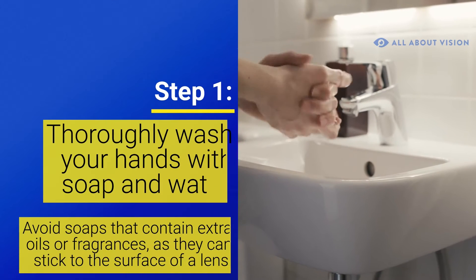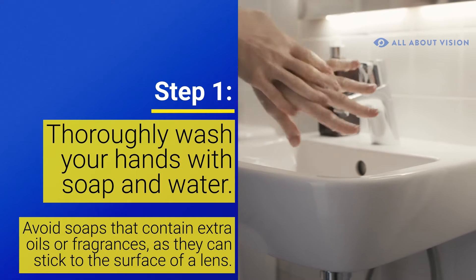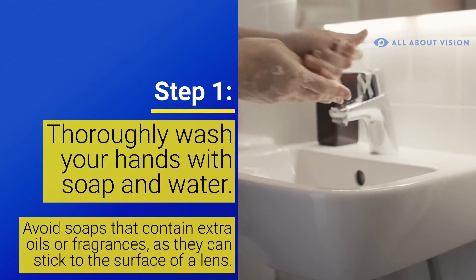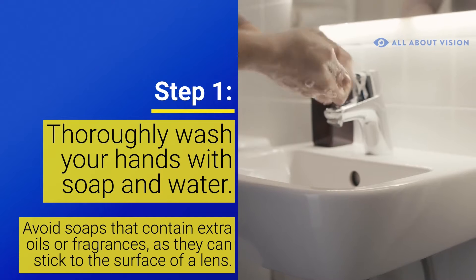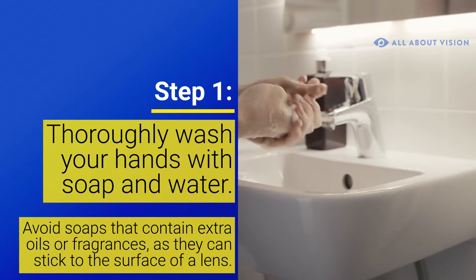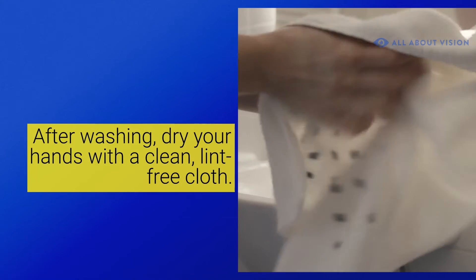Step 1. Thoroughly wash your hands with soap and water. This is a very important step. Touching your eyes or contact lenses with unwashed fingers can lead to infection, so make sure your hands are clean before you put your contacts in. Avoid soaps that contain extra oils or fragrances, as they can stick to the surface of the lens. After washing, dry your hands with a clean, lint-free cloth.